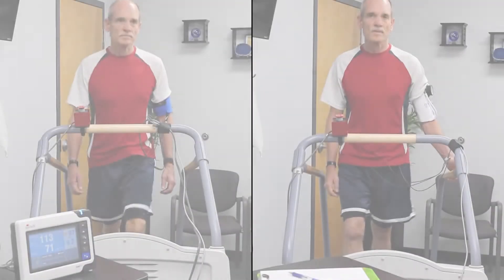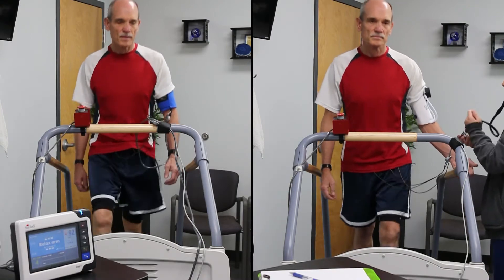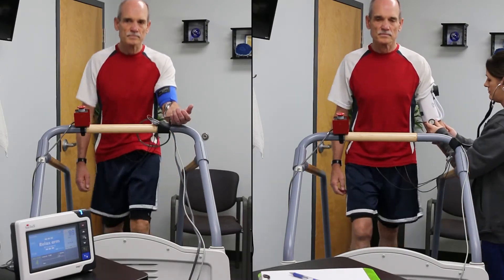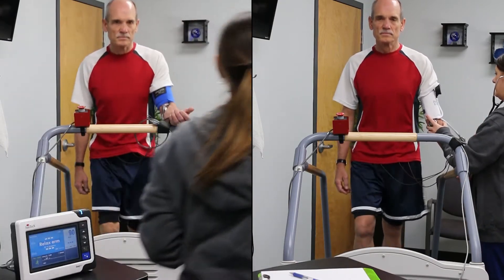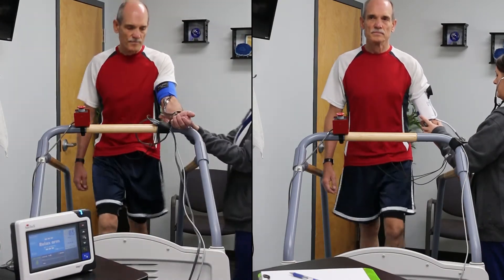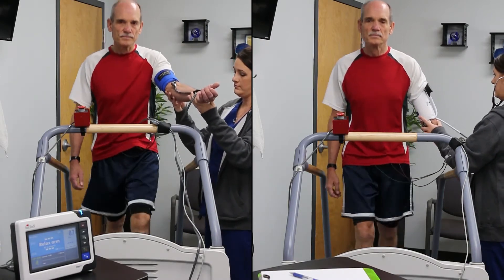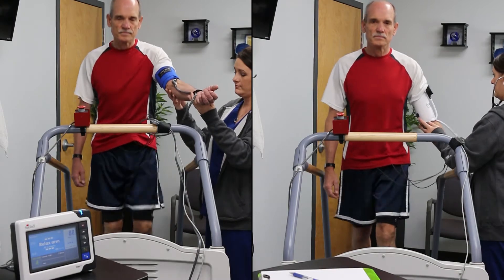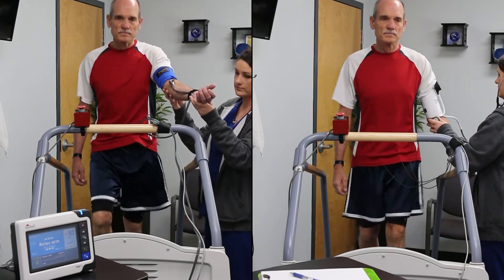Now the stress test has begun. During the measurement, the clinician may choose to support the limb of the patient if they have trouble holding it somewhat still on their own. During the stress test, blood pressure is typically measured at the end of each stage. The Tango M2 can be programmed to take measurements at the correct time during the test automatically.